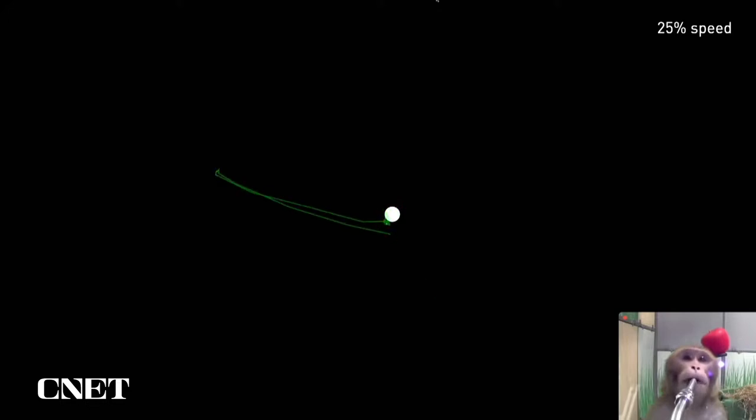But here we stimulate, and he makes the same saccade to the same location, because we stimulated the same electrode. Nothing appears on the screen at that time, and he has no other cue to make that eye movement. Let me show you this in real time.